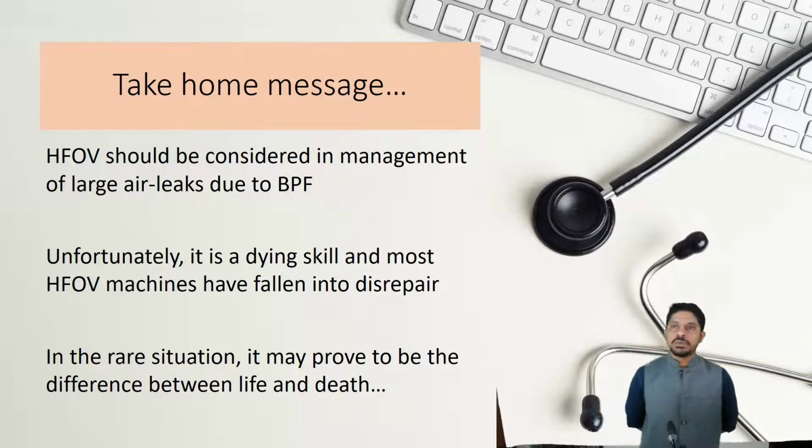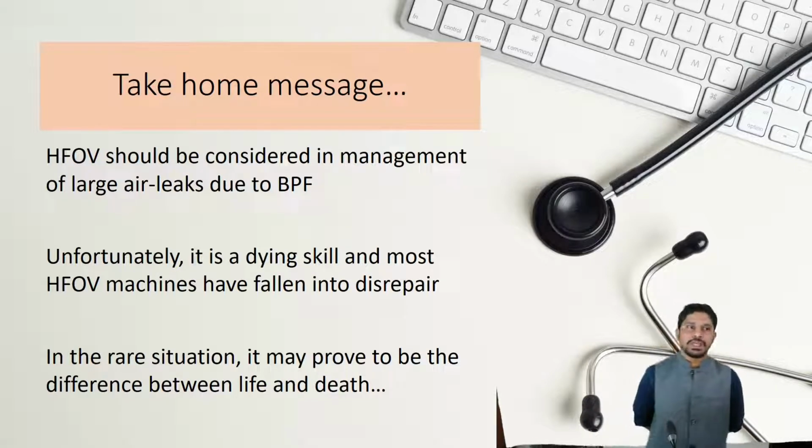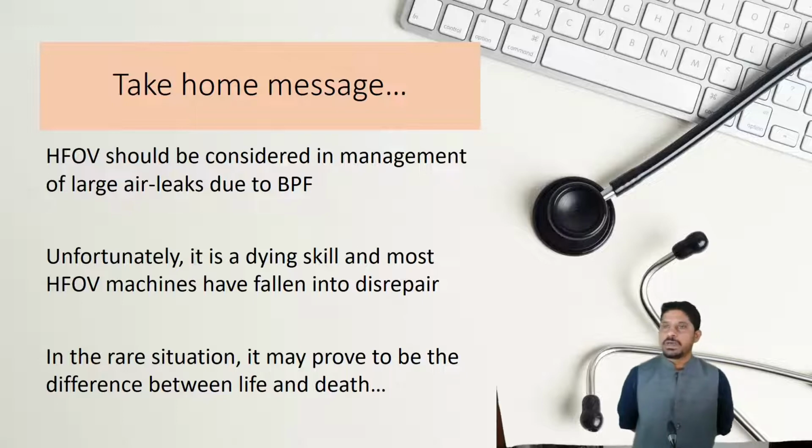It is actually a machine in the true sense. It is less of a computer. It does not have any microchips. It does not have much complicated electronics. It is a very basic machine, very easy to maintain, very easy to repair, and very easy to operate. So if we have the machine in our place, we should keep it ready. We should keep it in working condition for the rare situation where this may prove to be the difference between life and death. Thank you.